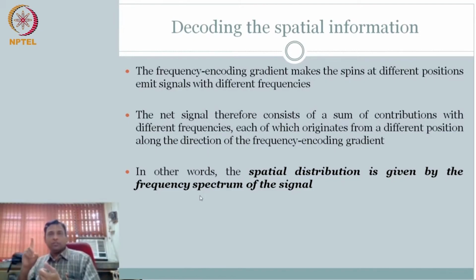I have contributions of different frequencies. What is that? That is your frequency spectra. So the frequency spectra contains information about the spatial distribution. This is very powerful. So now we understand this meaning. The signal that we have captured has contributions from different frequency components, so we get a feeling that whatever we are capturing is actually the frequency spectrum. But let's put the equation and see whether we recognize that.